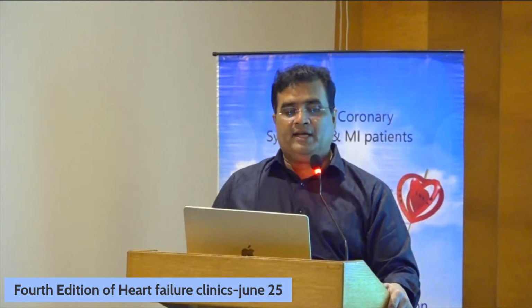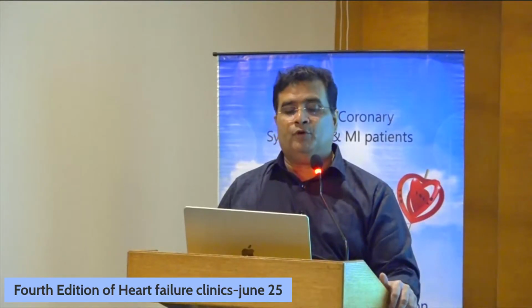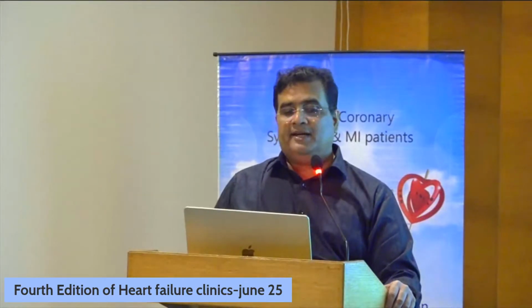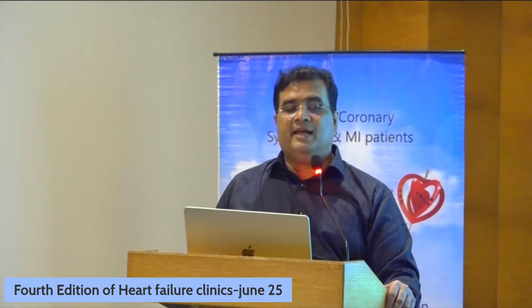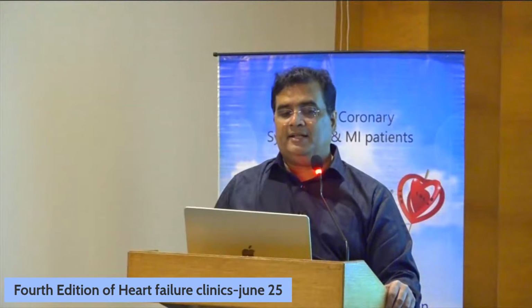Cardiac sarcoidosis is a very common entity. Nowadays I would be picking up about 3 to 4 cases of cardiac sarcoidosis in a month. If you start investigating further, you will find these entities in our day-to-day practice. And then I would show you some cardiac sarcoid images, and we can see cardiac amyloid also, where we do a technetium pyrophosphate scan to see an intense myocardial uptake and a suppression of uptake in the rest of the tissues in the chest.